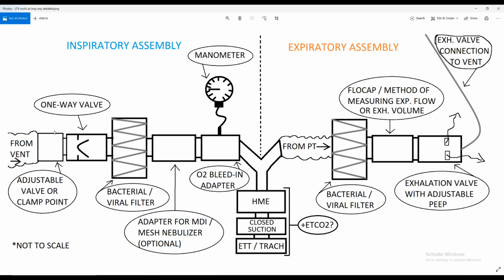So again, I didn't think of this all on my own. I was watching a bunch of other people's videos and posts. Some of them featured some sort of adjustable valve, so I'm just, again, taking a cue from that and adding it into my proposed setup. I think that needs to go right here. Whether it's an adjustable valve or it's just a clamp point that you clamp with hemostats. I don't think it would be a good idea to clamp the actual corrugated tube itself, because it seems like that would sort of lose its integrity and wear out kind of quickly. But I guess if you had to clamp the corrugated tube itself, you would. But I would just try to find something else to use as a clamp point.